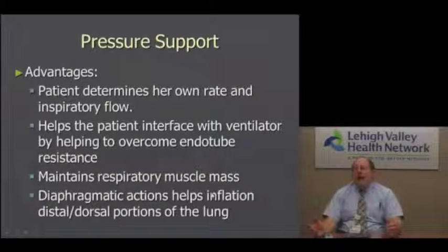The big advantage to pressure support, and it's a huge advantage. I don't know if anybody that I'm going to be talking to in this tape has ever been on a ventilator, but you got to understand, when I set a ventilator on CMV, for example, and I set a rate of 15, every 4 seconds that ventilator is delivering a volume of gas. If you don't want it as a patient, tough luck. It's coming at you. This can be extremely uncomfortable, and it can be anxiety-riddled for the patient, because the machine's forcing air on him.